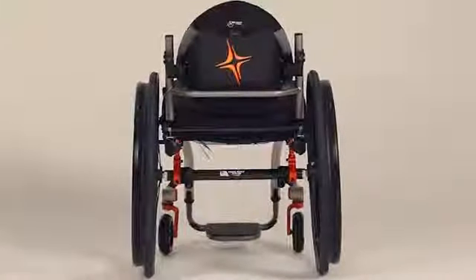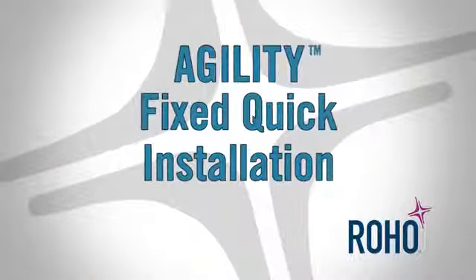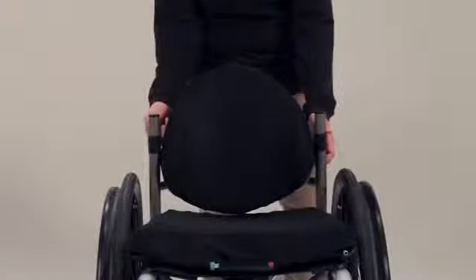When you're installing on a wheelchair without push handles and with a 1-inch wheelchair cane diameter, use the quick install method for a fast and secure fit. Simply loosen the hardware bolts on both sides of the back. Slide the back cane bands onto the wheelchair canes. You do not need to remove the hardware bolts or unclip the back cane bands.